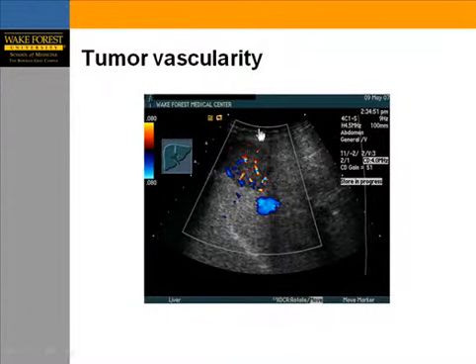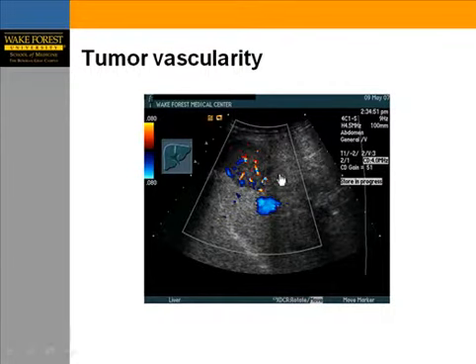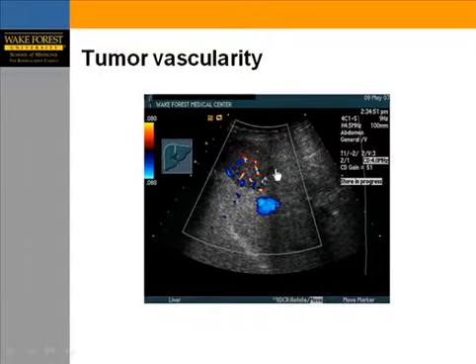Another example of a mass in the liver: this mass shows a spoke-and-wheel pattern, which is typical of focal nodular hyperplasia.